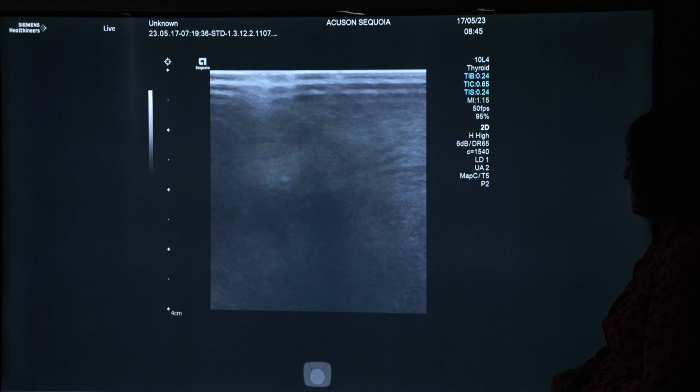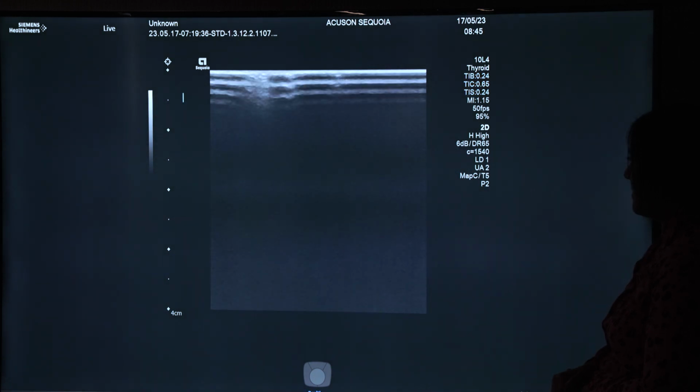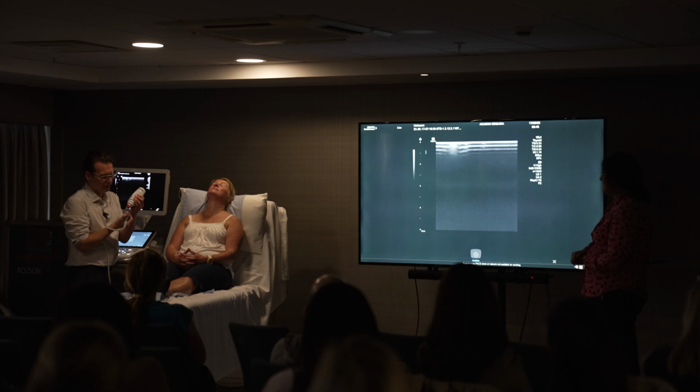Okay, so next one. Once we're finished with that, I want to do the parotid.